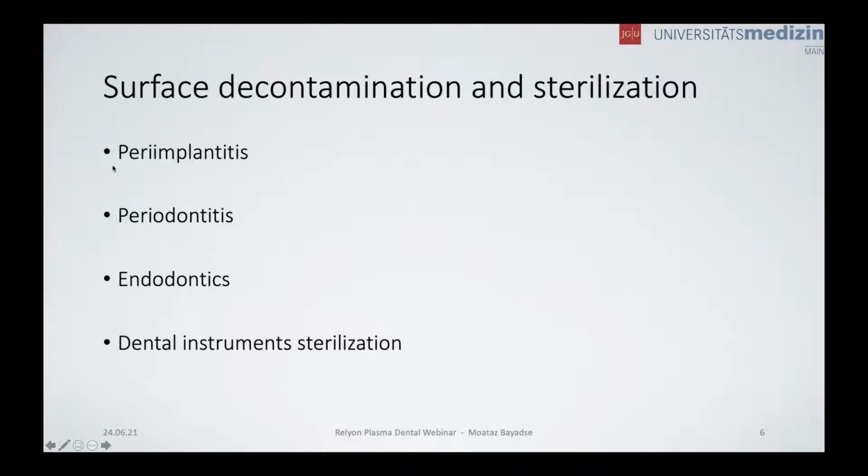In all three fields, peri-implantitis, periodontitis, and endodontics, it's all about elimination of the inflammation or decontamination. So cold atmospheric plasma has promising potential to be used as a supporting method to heal those diseases. And cold atmospheric plasma can also be used in the disinfection and sterilization of dental instruments.